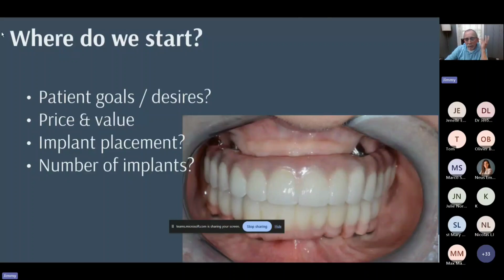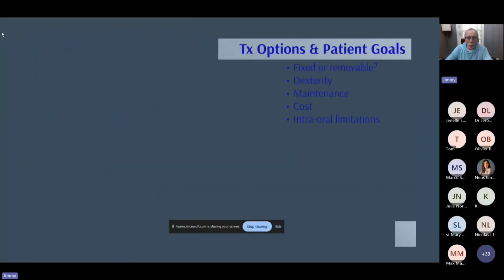And so the initial reaction was, let me just add some more pink up there to stop that. But then we can't do that because it's already hard enough to clean. And if I had a flange, then she certainly would not be able to clean it. So that's why we had to switch this to a conus, something she could take out, but we were able to give the flange for the right lip support.